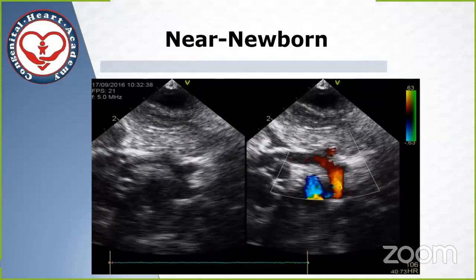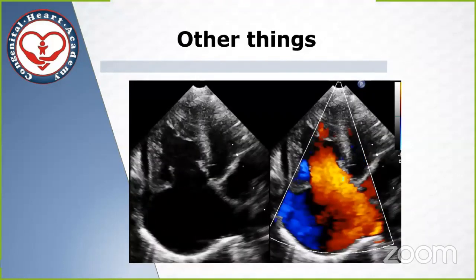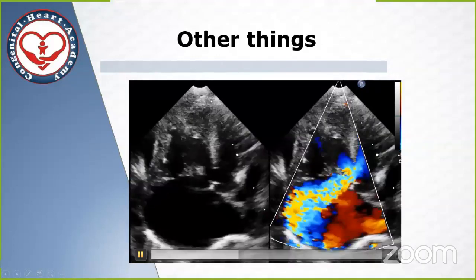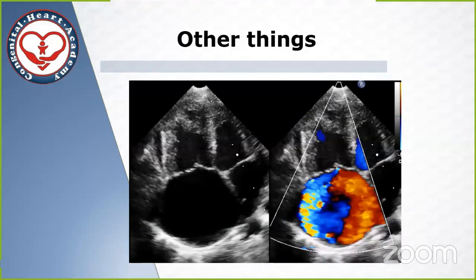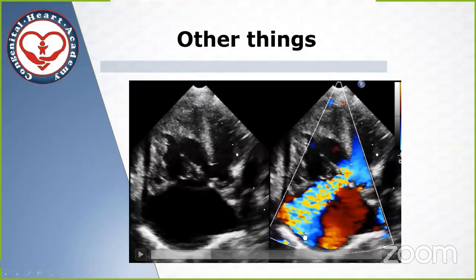We have to keep a diagnosis very simple, because then there is the second step, which is to call the cardiologist for a final diagnosis. But here we want to make sure that the audience is looking at a big right ventricle with a big right atrium, and there is an abnormal shunt between the left ventricle and the right atrium. This is what we call the Gerbode shunt, and this is a residual shunt in a postoperative surgery of an AV canal. So a shunt between the left ventricle and the right atrium.